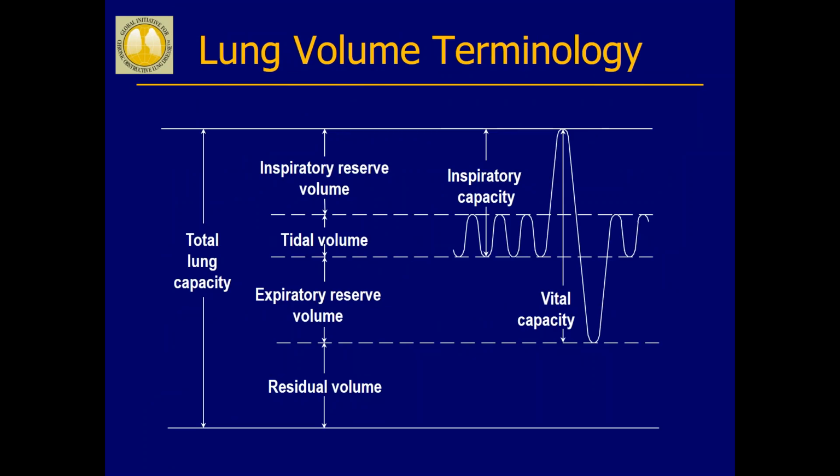And so just for people to understand when I'm talking about the different volumes in the lung volumes assessment, if you imagine your total lung capacity on this graph from the top and bottom lines, when you take a breath normally, you're actually in the middle point of your capacity. You have some air in your lungs, and you are breathing at a consistent rate, probably about 20% of what you can likely totally breathe in and breathe out. And that's considered tidal volume, breathe in, breathe out. If you take a deep breath in, you go up to total lung capacity, and the difference between your normal tidal volume capacity and the total lung capacity is this inspiratory capacity.